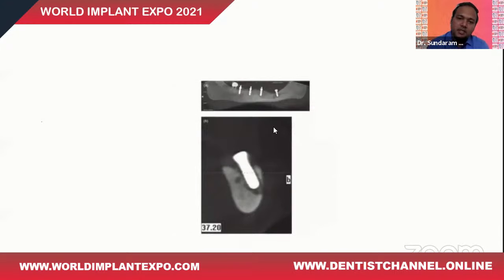This is yet another picture which we have seen previously. This is the orthopantomogram view. Of course, it's from the CT, but even the OPG gives you the same effect. It is nicely surrounded by bone, so we all think it's a healthy implant, but it's only the cross-sectional slices that would give us an idea of how far the lingual plate has been perforated, and this in fact is a failing implant.